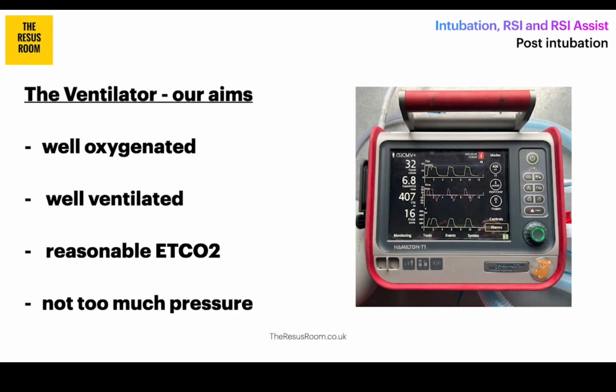So the first question is, what goals are we going to be looking to achieve by using a ventilator? Well, ideally, we want a patient who is well oxygenated, and that's using that Goldilocks analogy. We want to avoid hypoxia, but we also want to avoid hyperoxia.